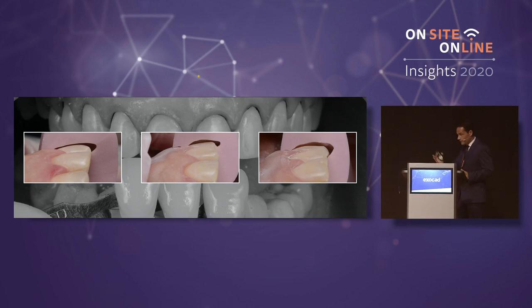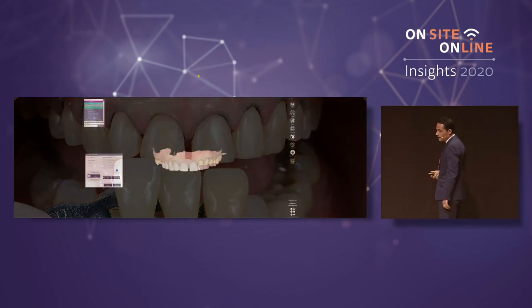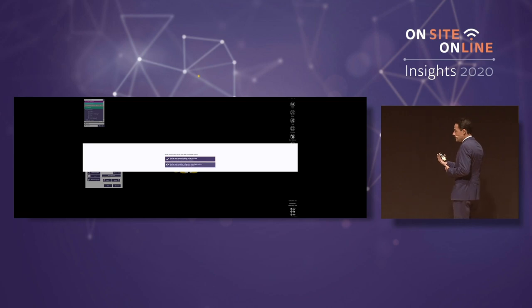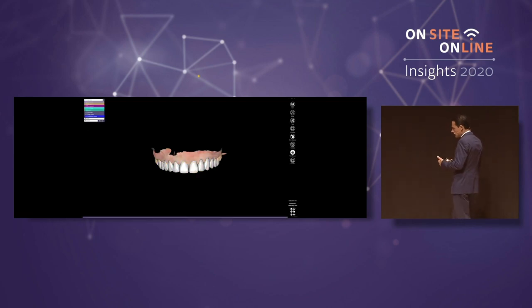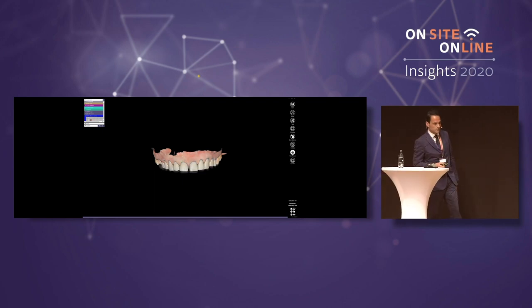The doctor, Roberto Patros, made these preparations. He sent us the 3D model. And with the patient still in the dental office, we value that the prep lines are correct, that we have enough space. We can do that thanks to the intraoral scanner, for sure.